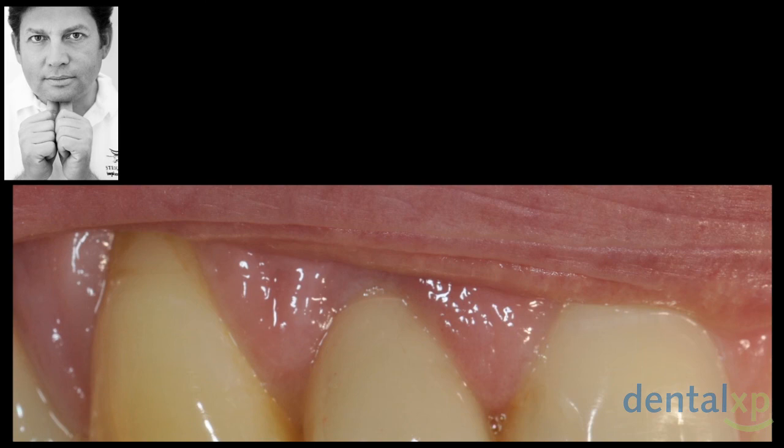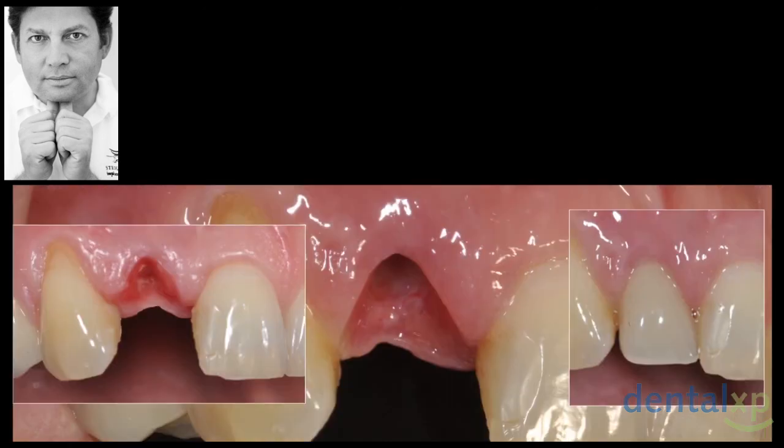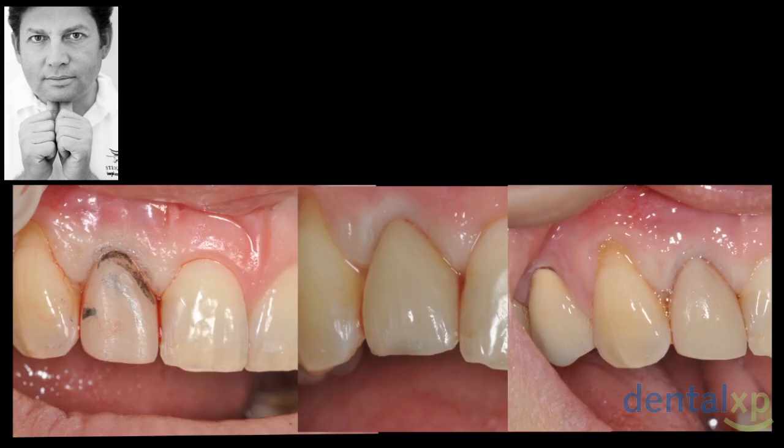So now we can play a little bit with the soft tissue. In this case, I told you we reduced the temporary crowns. In this case, we are using temporary crowns because we have a thin biotype patient. And what we are doing now, we are creating this soft tissue environment. See, the papilla here was gone. Here, it's very long, more than 50% of the emergence of the crown length. Then we can create, without soft tissue surgery, a good environment for the soft tissue by using these developments. You can see, this is the final crown trying. We are just reducing. We expect a little bit of coronal creeping of the soft tissue. And when we have the final aspect, we can go ahead and restore that.